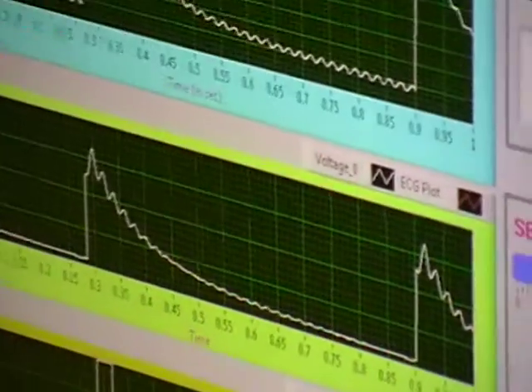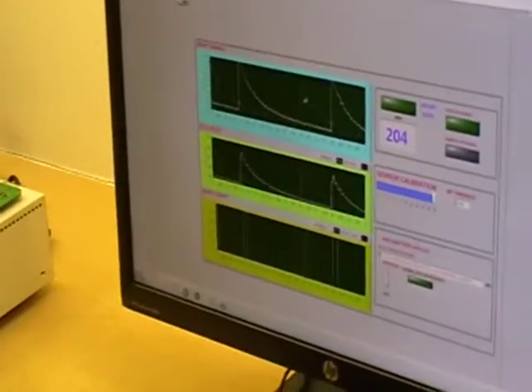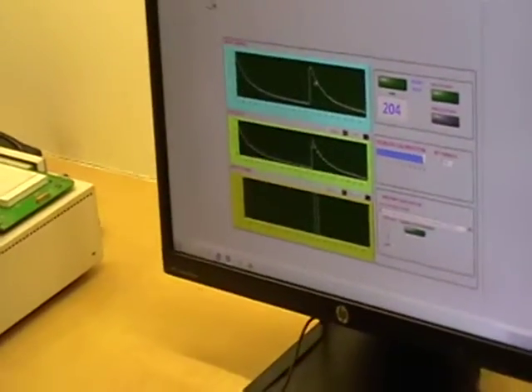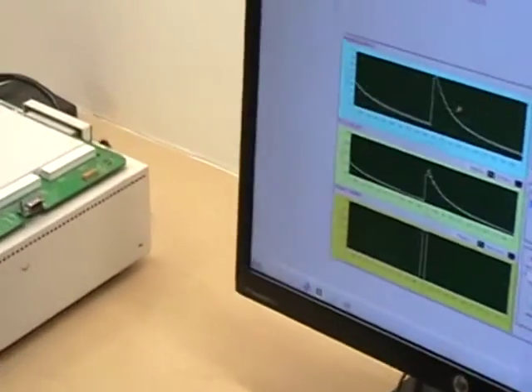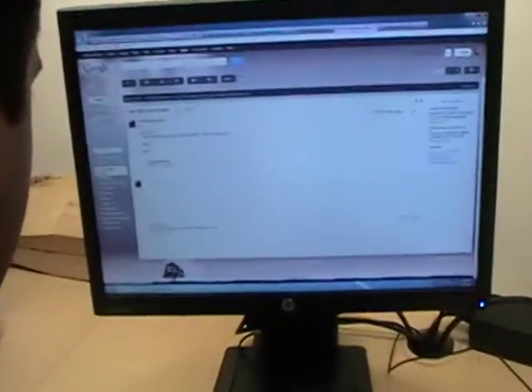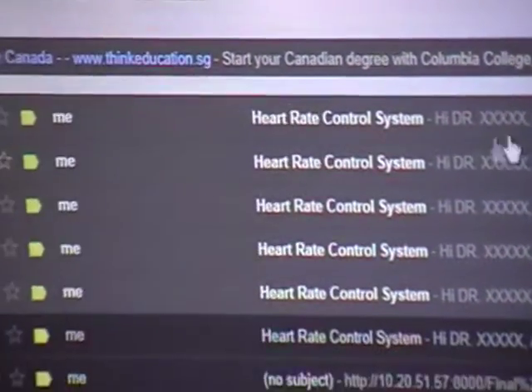So what happens is that whenever the system is running, the electrical pulses will be saved to this data file, that is heart rate data, and will be sent through the email server to a particular person's email. We can see this information when I go to another PC and access the email, and you can see that the system has sent a few emails. So we will take the first one and see.